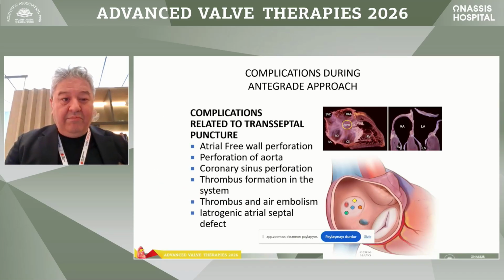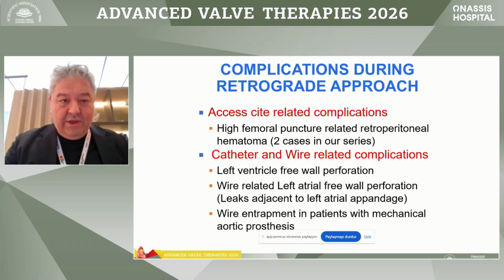And what are the complications related to transseptal puncture? As we know, we have to consider perforation. Thrombus formation in the system can develop, thromboembolism and air embolism, and iatrogenic atrial septal defects. So we have to be careful during the transseptal approach.